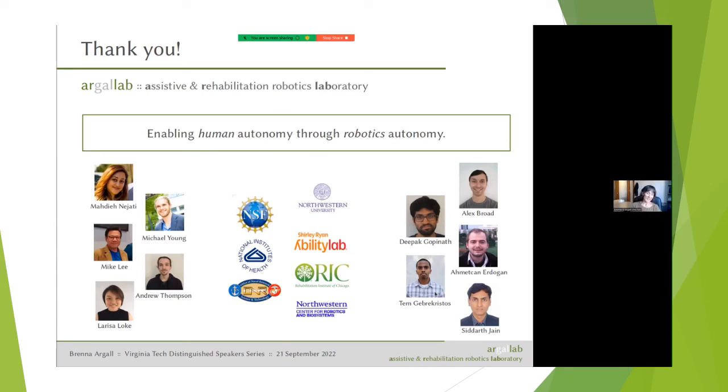Yeah, there's a number of challenges. So I guess I'll start out by saying that there is one company that provides a sensor-based safety package for wheelchairs. They came on the market in 2022. They're actually collaborators of ours. They're awesome. And they provide only subtractive assistance. So they only ever take energy out of the human's control signal. They never add to it. So they can do it directionally. They can steer you because they slow you down in one direction. And they do this to avoid collisions and avoid drop-offs.